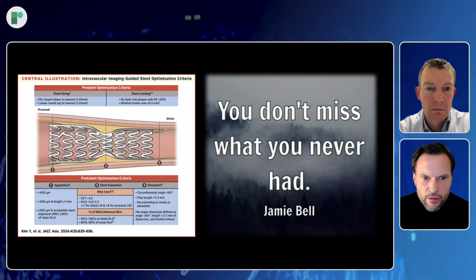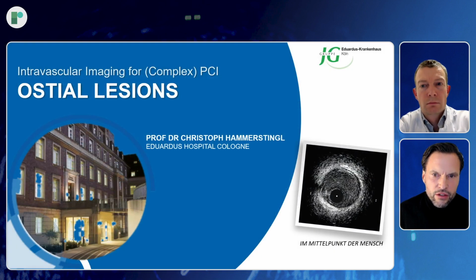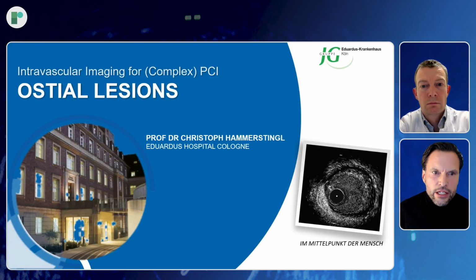So from my point of view, we might not really estimate the total amount of complex situations if we don't apply intravascular imaging more in daily routine.